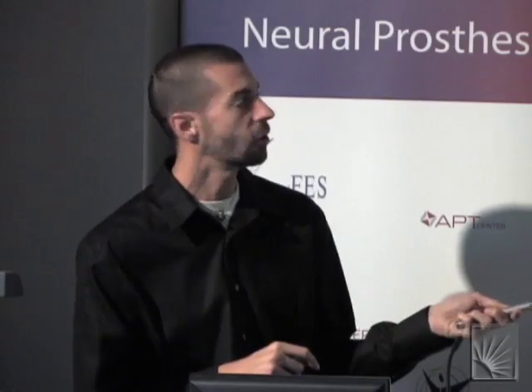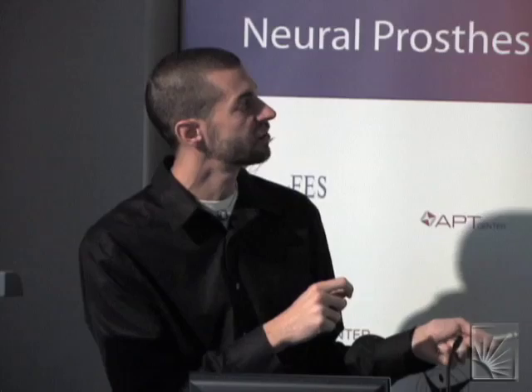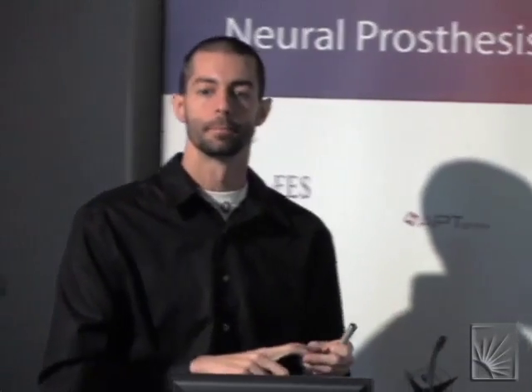So everything in the core of that volume is so super threshold that little inconsistencies in the models are meaningless, really. It's active, and it's way active. The ones that are questionable are right at the periphery here. But actually I would estimate that that stimulation spread error is less than the atlas placement error. You know what I mean? So that was the question, right? Like how do all these errors compound? And it works, right? At the end, like you showed. Okay, so it works.